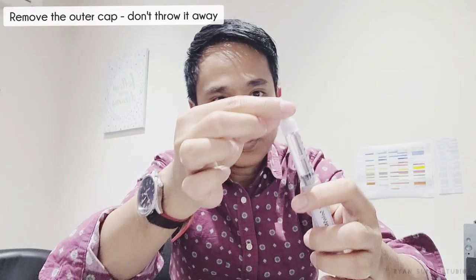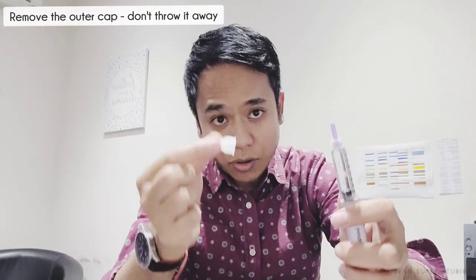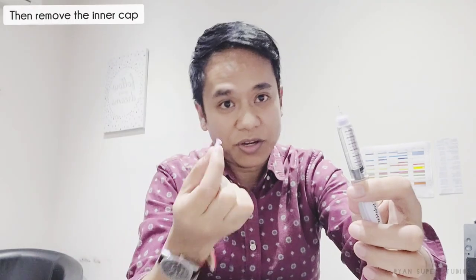Remove the outer white cap — don't throw it away, because you'll need it later to safely remove the needle after use. Then remove the inner cap, which you can throw away. That's your needle — it's very fine and very small.